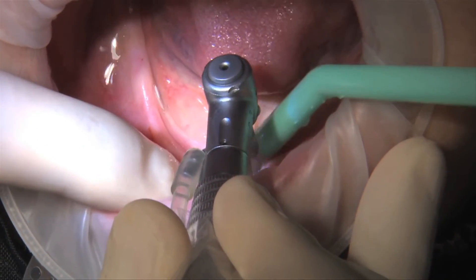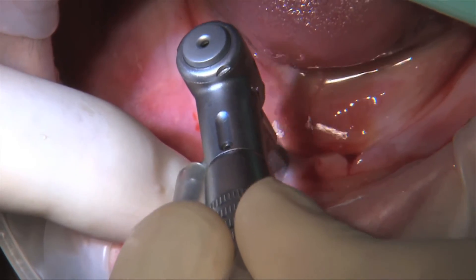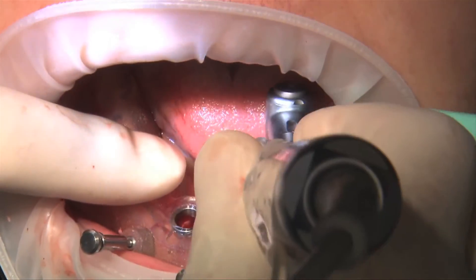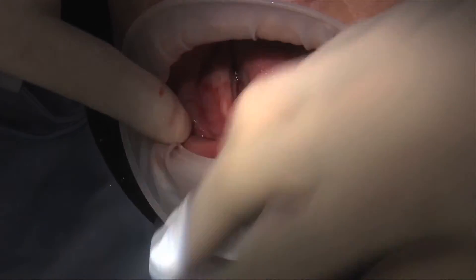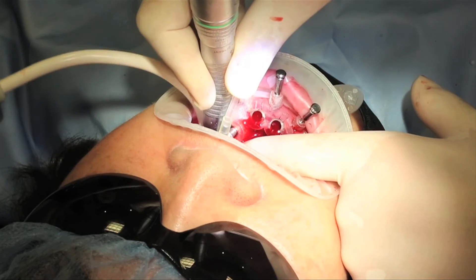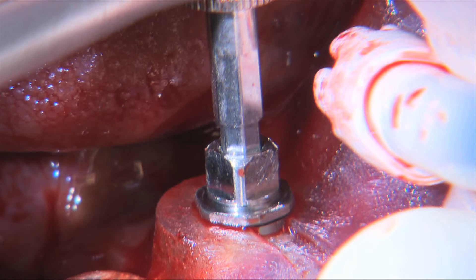After using a gingival tissue punch, the guide was removed to facilitate removal of the tissue at the implant sites. The index was again used to position the guide following tissue removal and the fixation pins realigned to their holes without incident. The surgical guide was then used to prepare the osteotomies and guide the placement of the 4.7 millimeter implants.